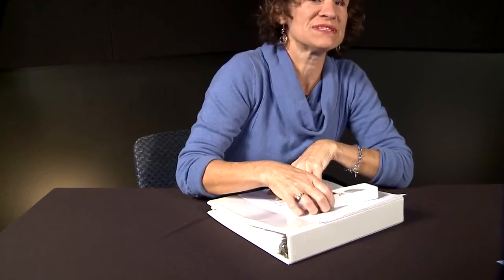Again, hand position, just as in Braille instruction, working with a student on developing that fluid movement is as important when training with optical devices. Paying attention to these habits is essential. It helps for students to be able to understand some of that science of optics as they're working with a magnifier. And again, they're gaining that expertise of developing that skill of working with a tool.